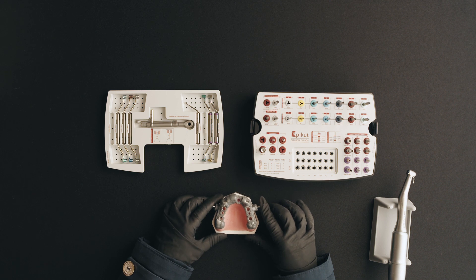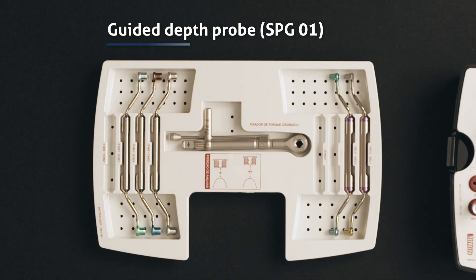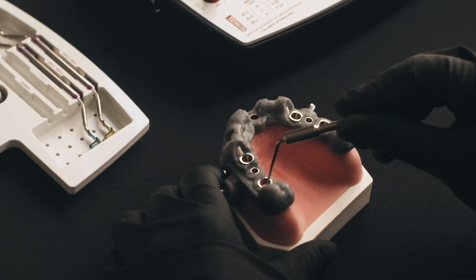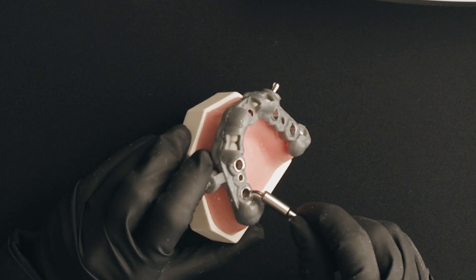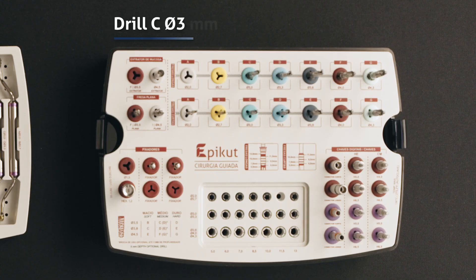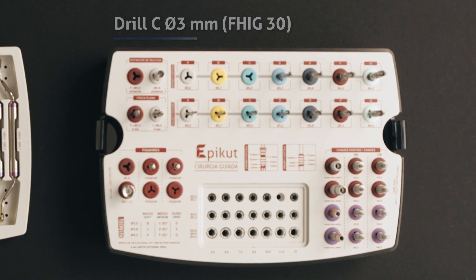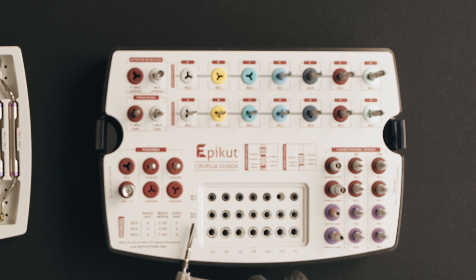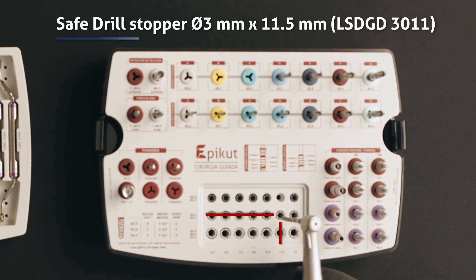If you have any doubts about the depth of the drilling, you can use the depth probe to verify it. If it's correct, go to the next drill, which is drill C, 3 millimeters diameter. Select the drill stopper for the 3 millimeters diameter and 11.5 millimeters length drill.